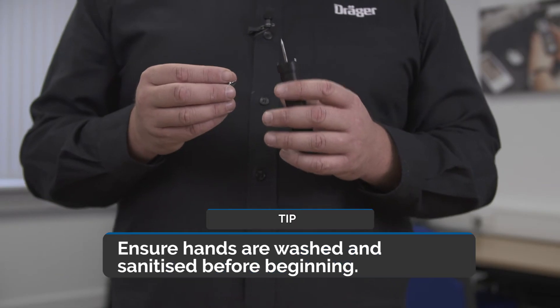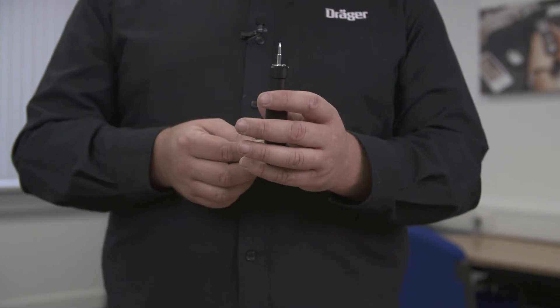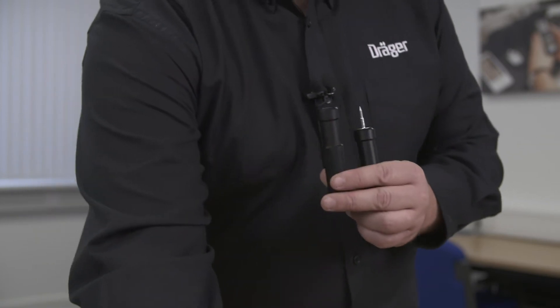To probe the mask you need your probing tool and your probe. Insert the probe over the top of your probing tool. Get the second part of your probing tool and insert the locking nut.